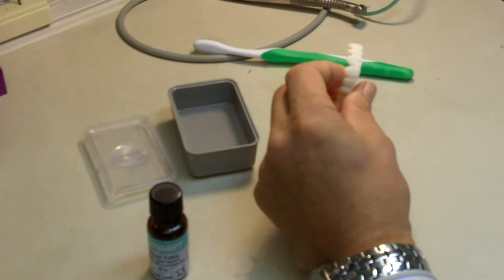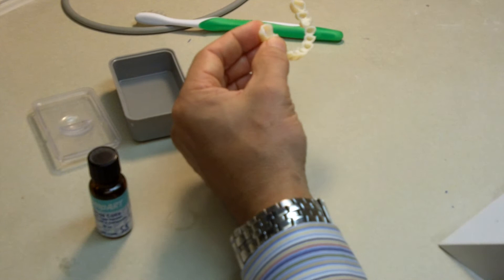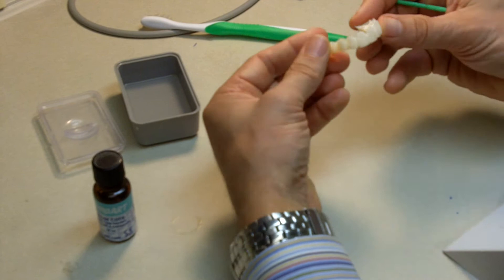For relining, I'm going to paint some of that in the areas that I want it after I've dried with alcohol the provisional. I could micro-etch too, but I don't need to. It's just going to work fine without that. So I had two little spots here. I'm going to light cure that.